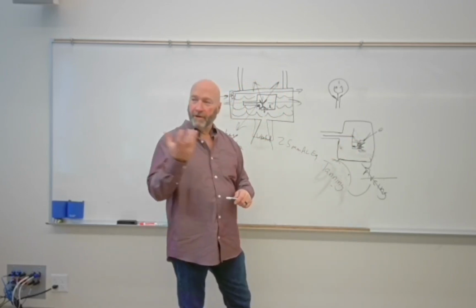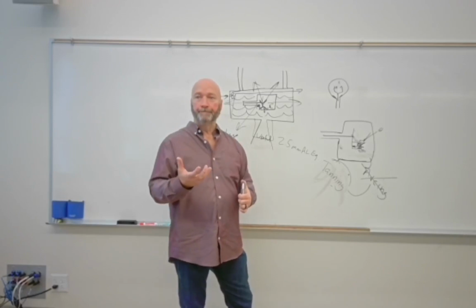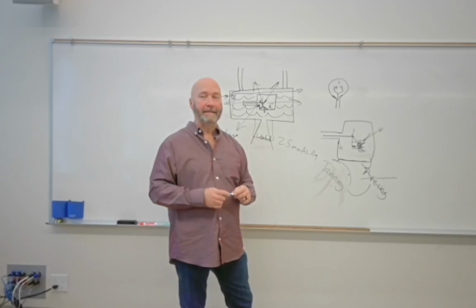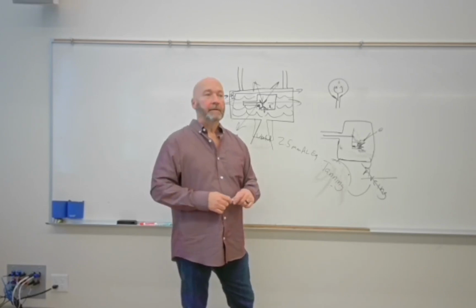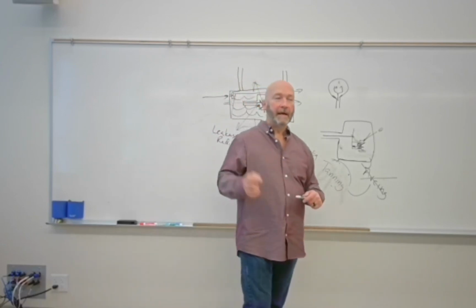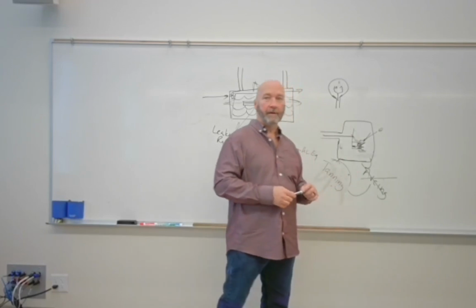Now, did you notice the backside of the target as it came around? It kind of looked like plastic back there, didn't it? That's not plastic, because plastic can melt. But what it probably is in that X-ray tube, being as dark as this, is probably graphite, a graphite backing.